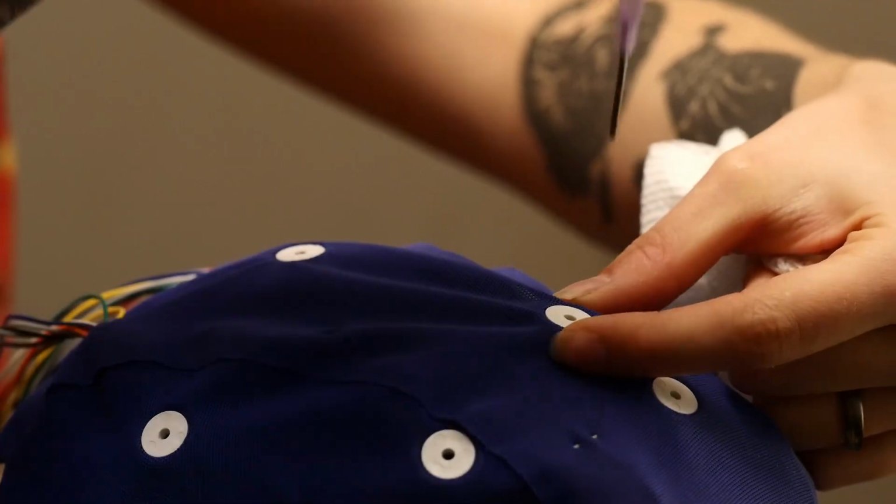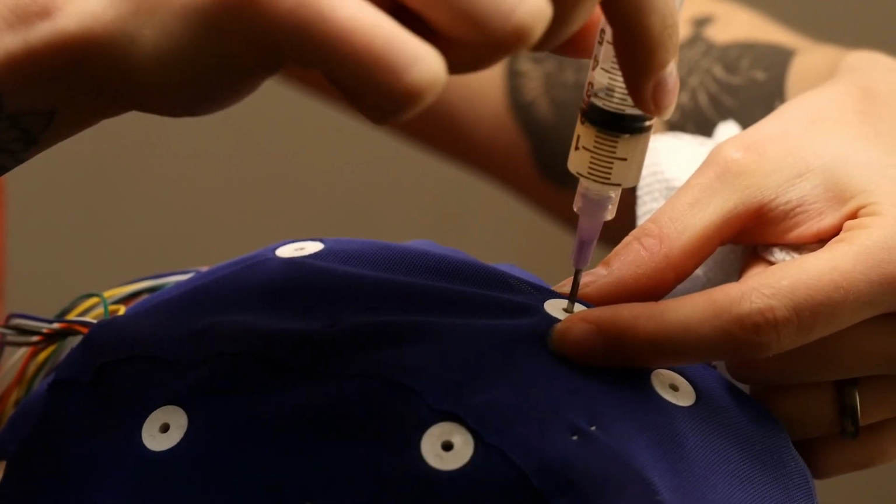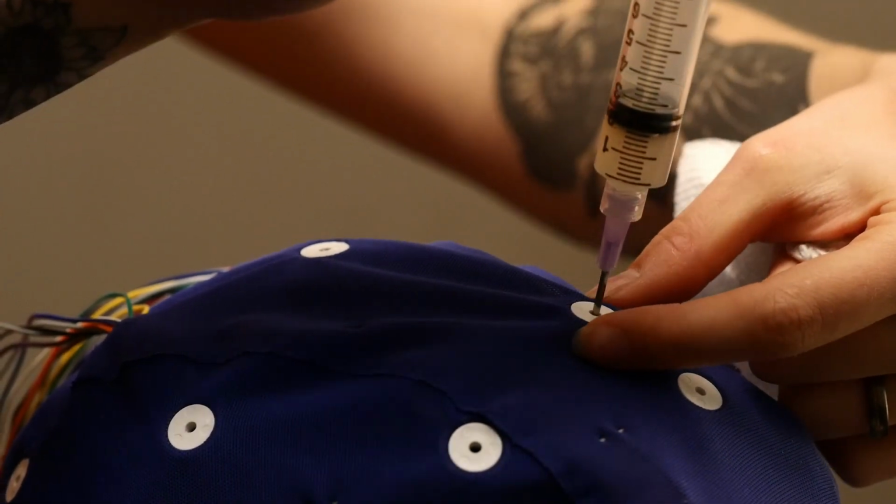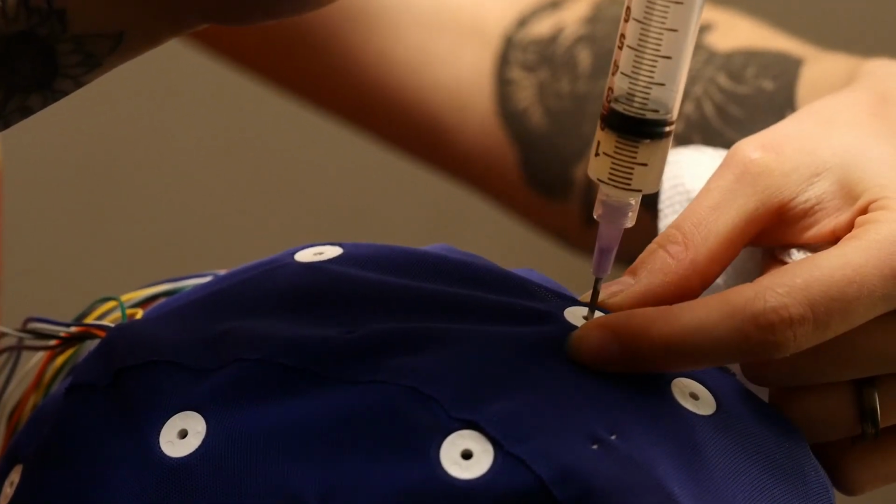Halt! Always hold your electrode. Now that we have our electrode firmly in hand, we are going to lift both the electrode and the syringe slightly away from the scalp. You can see me lifting it there.